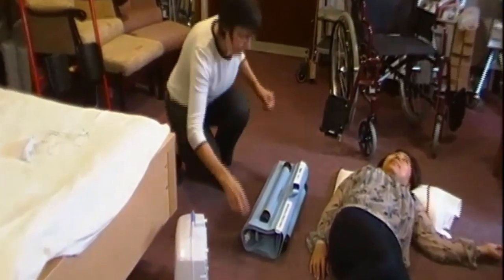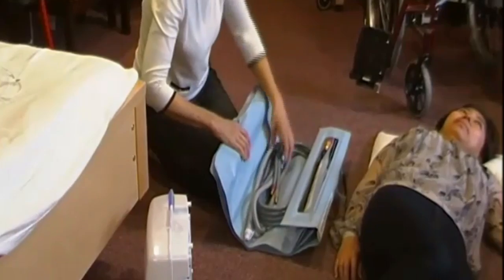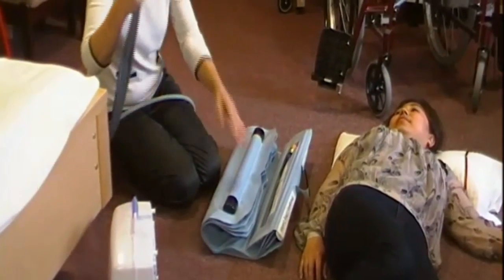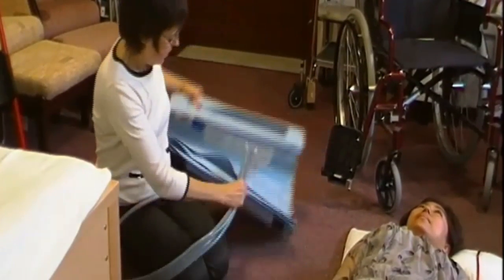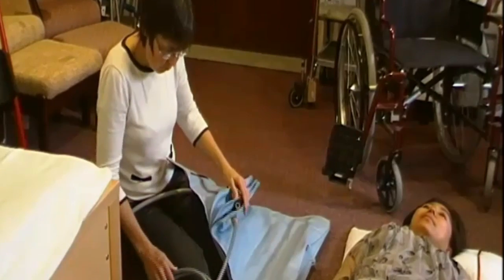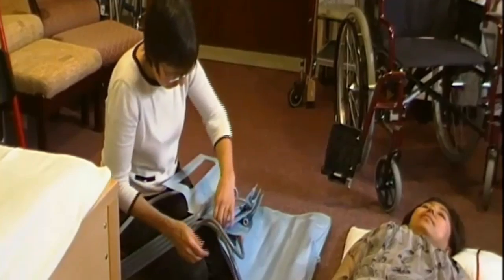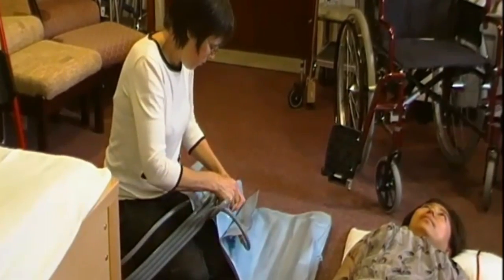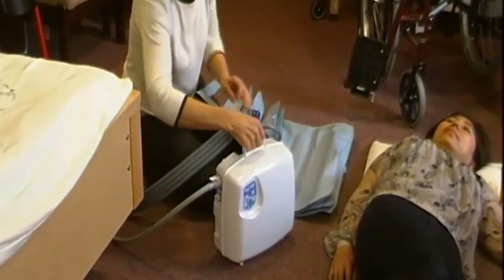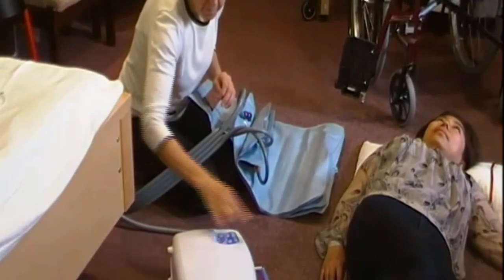So what we do, have you used this before, Grace? Yeah. Oh, right, so you're well familiar. It's very self-explanatory. You have colours and numbers on each of these tubes, and they fit to the corresponding connections on the cushion. So we have yellow, which is number 4, black is number 2, red is number 1, we have 1 missing, blue is number 3, and then the other end connects into the compressor, and it's the only place it fits, so it's quite simple. You switch it on and hear it burp. That's it.